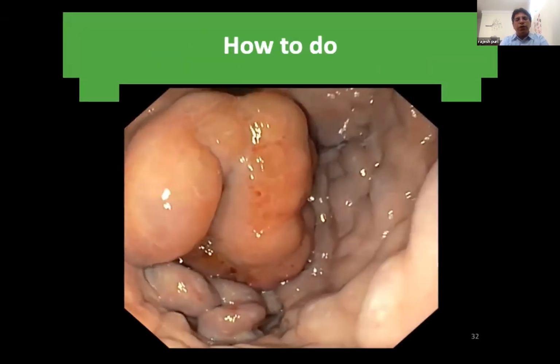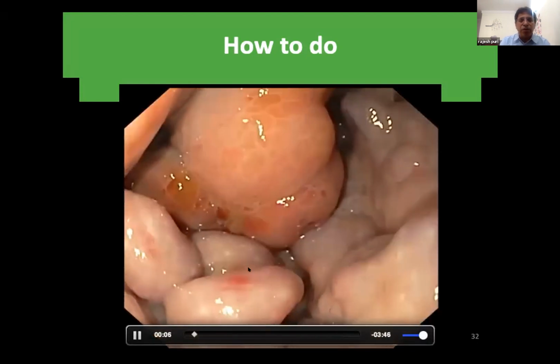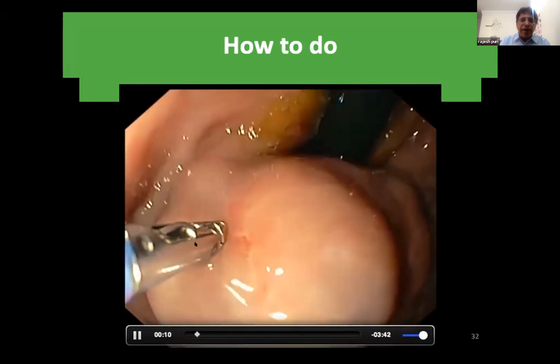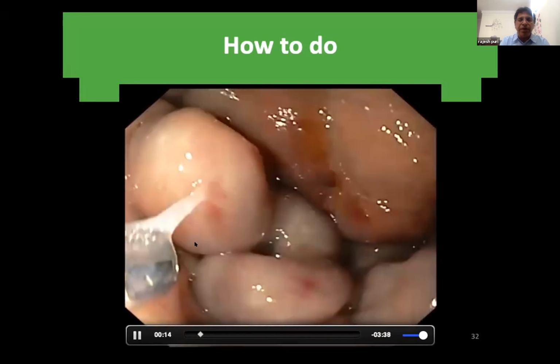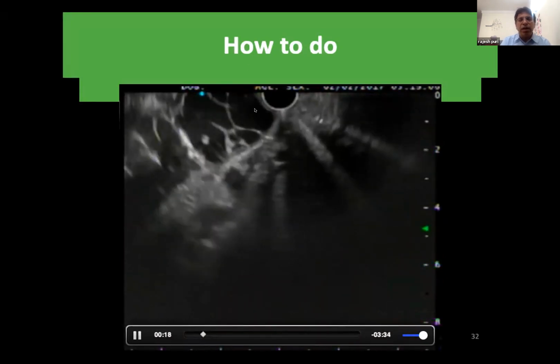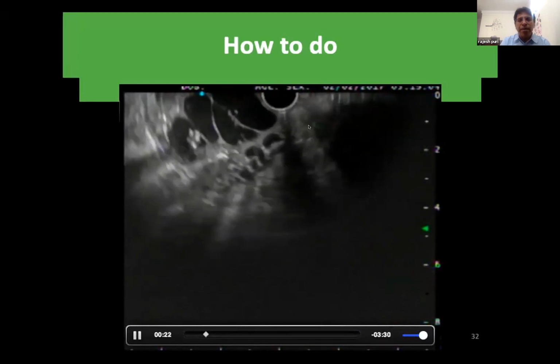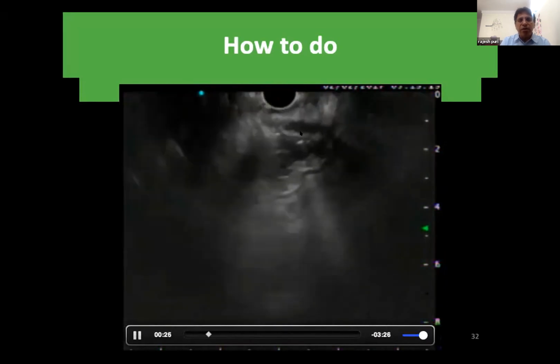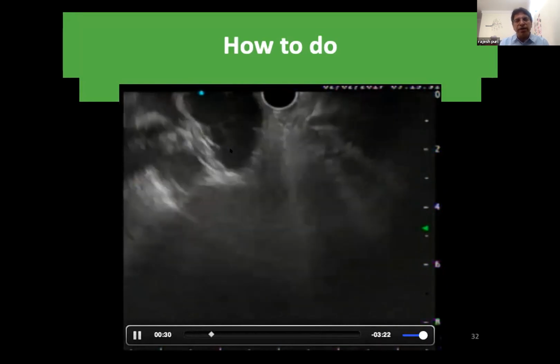So this is the thing. I always do the first endoscopy. You see a large bunch of the fundal varix with the small varices here. Confirm that the varix is patent. It is not obliterated by the previous person who has done it. EUS was done, and you can see the large bunch of the fundal varix. I'm going to introduce around 100 ml of saline or water into the fundus for better obliteration and to know about the mucosal aspect of the varices.